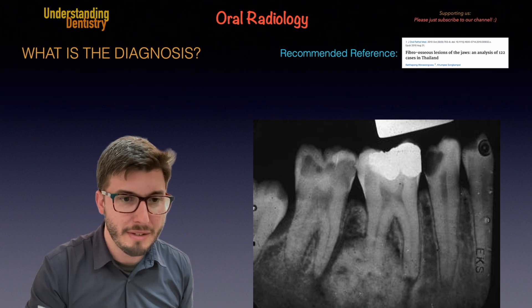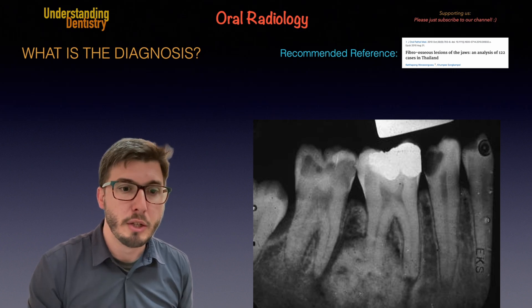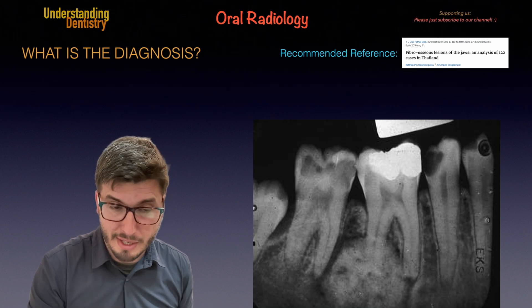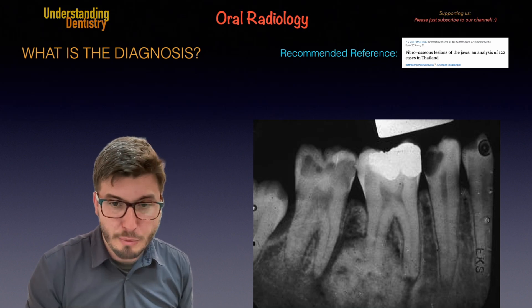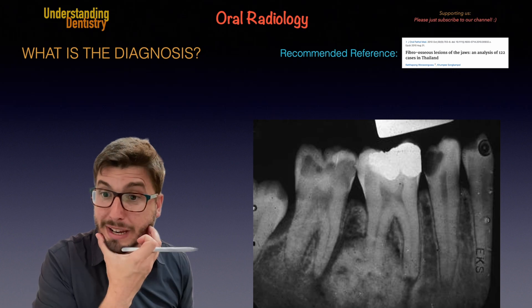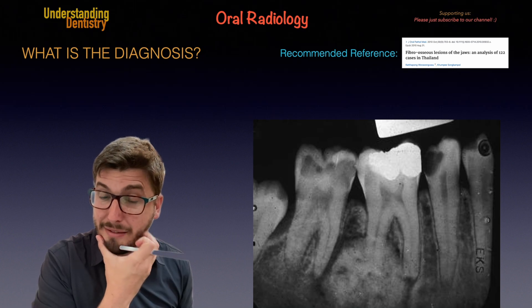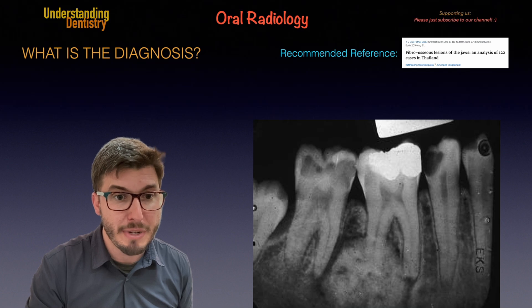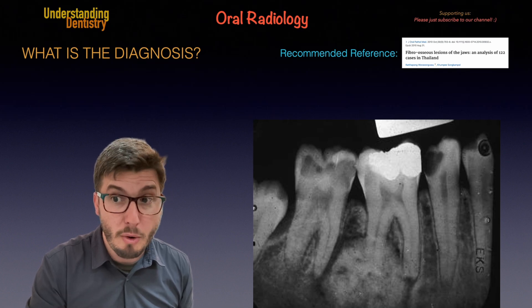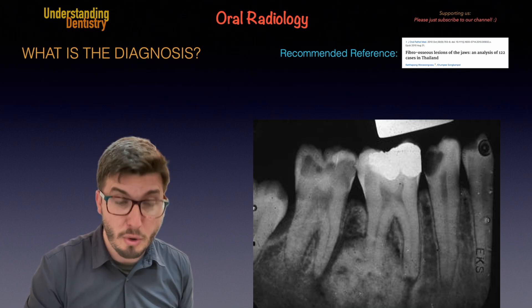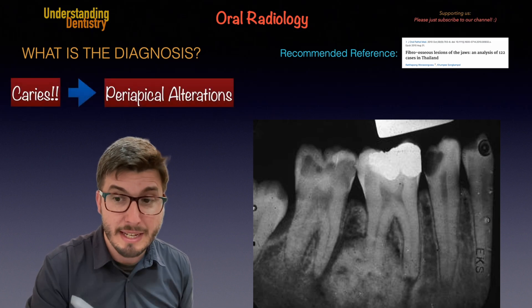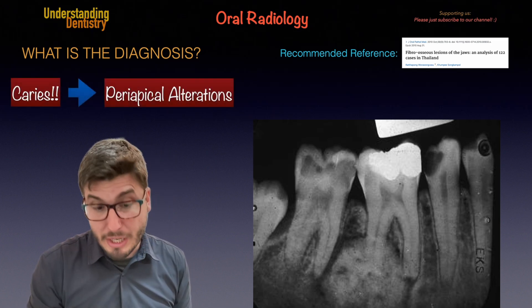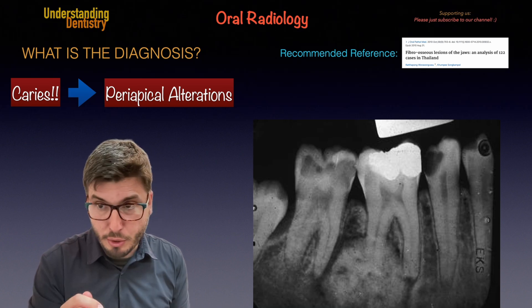Feel free to pause the video and try by yourself to diagnose all the conditions of this radiograph. Let's start without further ado by recognizing that we have a lot of caries. Which are the teeth that are presenting with caries? Well, all of them. So all of them are presenting with caries and this is leading to periapical alterations. So let's understand what's going on here.